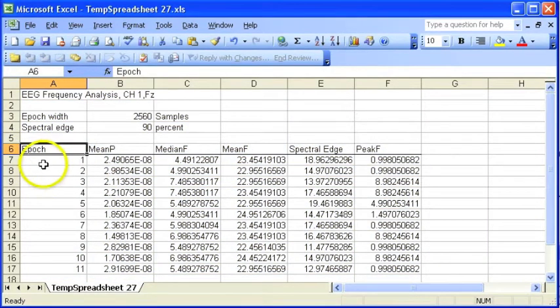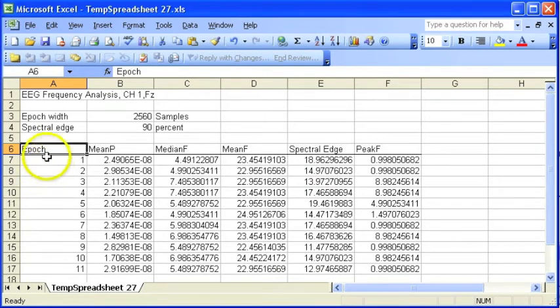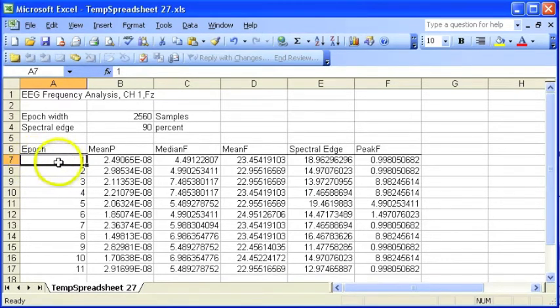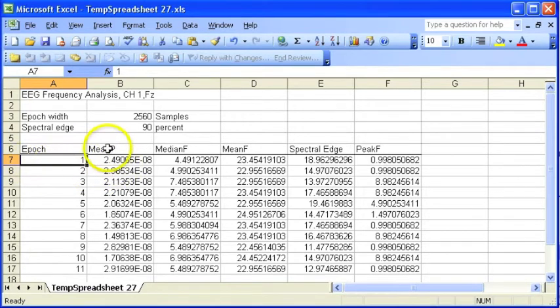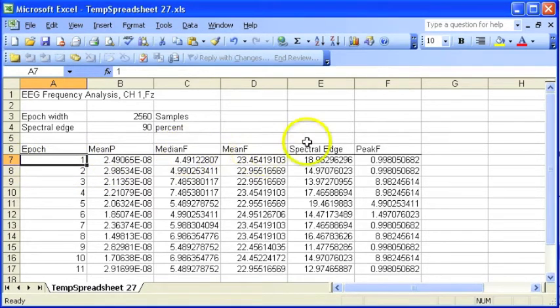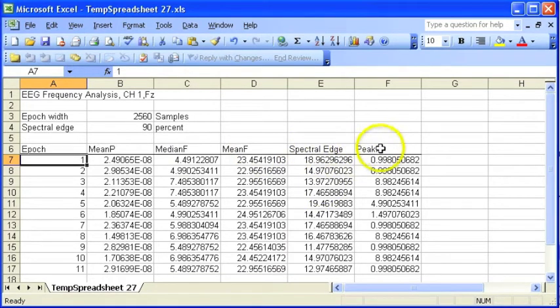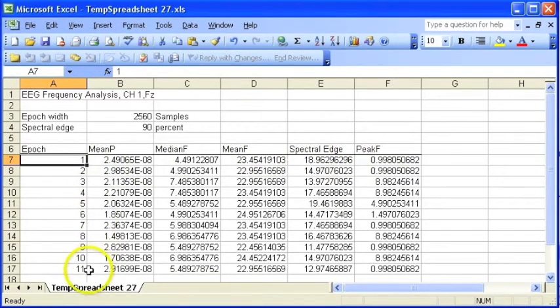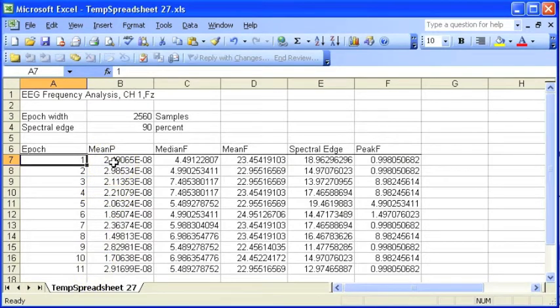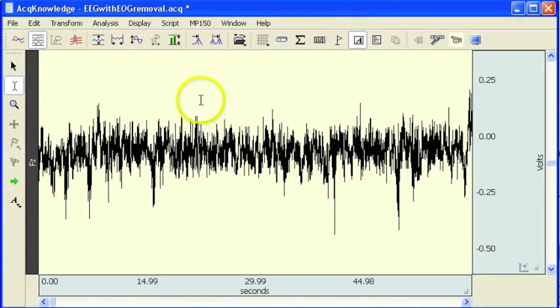So this is the measurement number that was taken. This was time 0 to 5 seconds, time period 1. Mean power, median frequency, mean frequency, the spectral edge, and the peak frequency for each of the 11 five-second bins that were analyzed in this particular file.